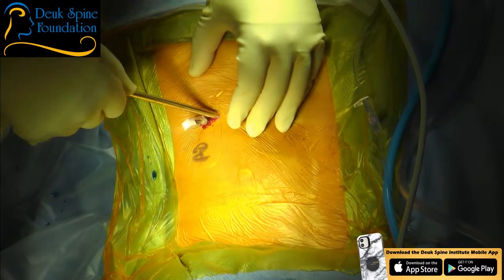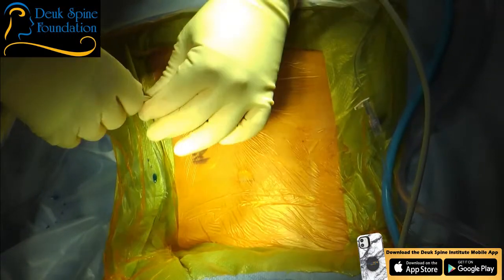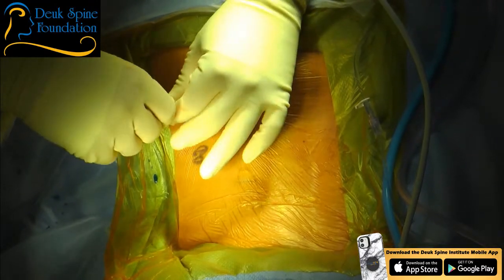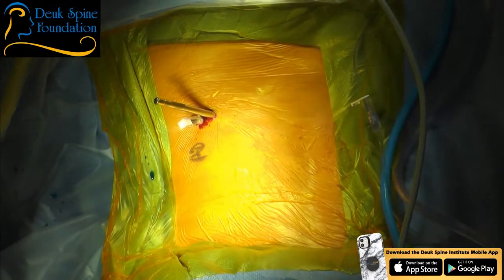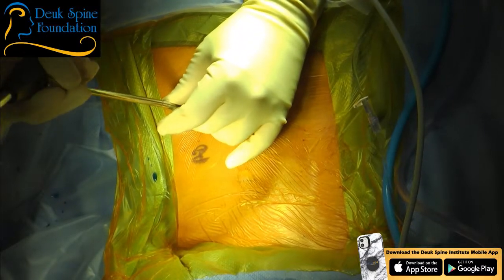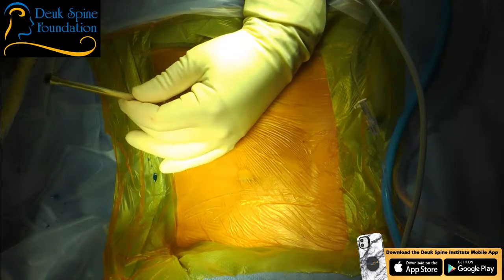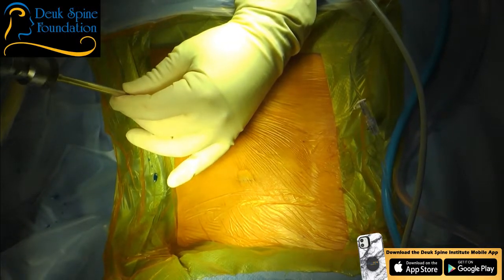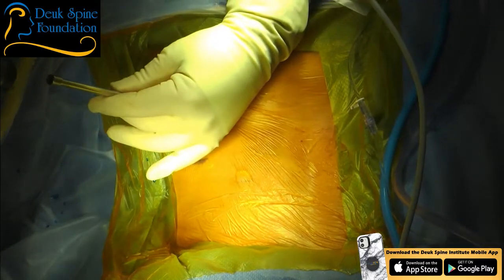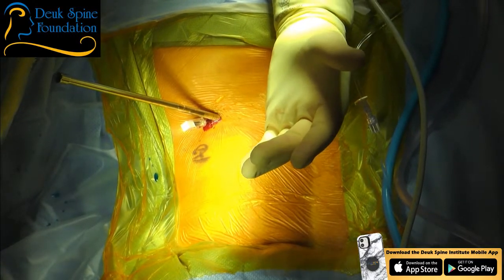So people wonder, how do you do this surgery? Well, what's really cool about the surgery is there's no damage to any of her body except the skin where I cut 7 millimeters. That's the smallest surgical incision there is in the world. And I passed through the muscles and the fat, which don't get hurt at all. You wish the fat was hurt so it would go away. But unfortunately and fortunately, none of this does any damage. It does a spreading motion. It spreads tissues apart, and because it spreads the tissues apart rather than cutting them, patients recover almost instantly from the surgery, like within 24 hours.